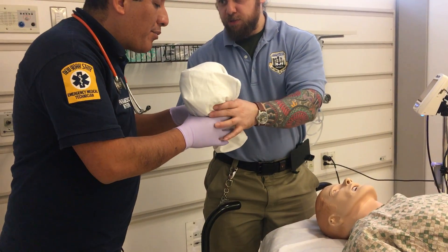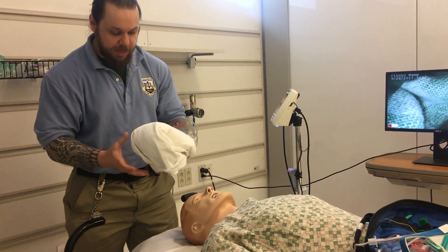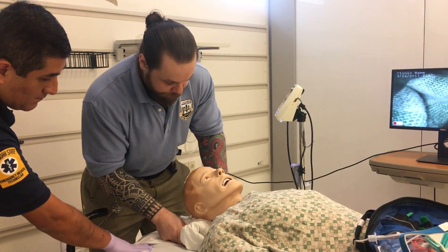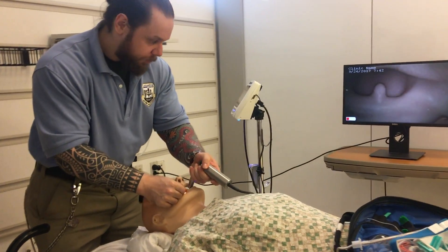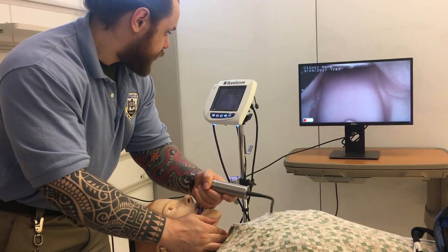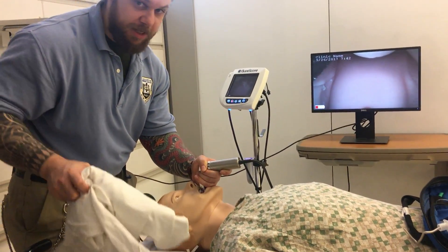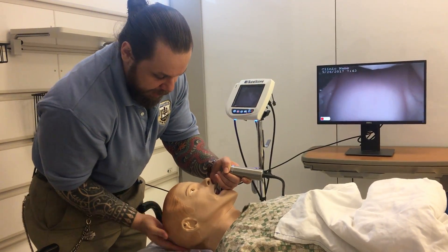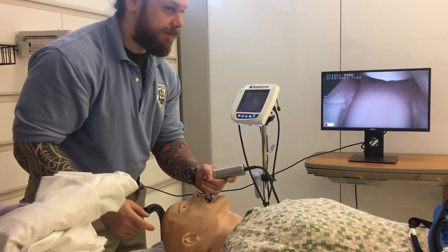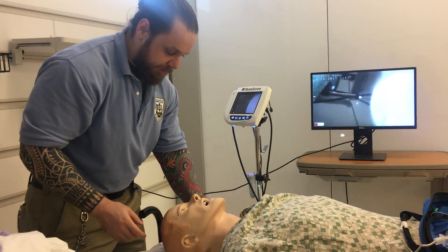He has the auditory meatus — the ear hole — aligned to the sternal notch, and that's what you want to accomplish. I want to have some padding under the head. I'm going to use the glidescope to show you the view. I see the top of the epiglottis, insert into the vallecula — this is the optimal view with proper positioning. Watch what happens when I take away the padding: the view collapses. When I realign the auditory meatus with the sternal notch you get an optimal view of the vocal cords, and when I let go you lose your vocal cords. Always align the ear hole with the sternal notch.